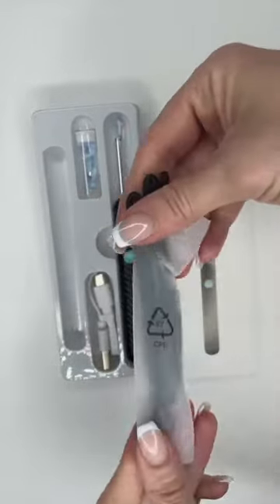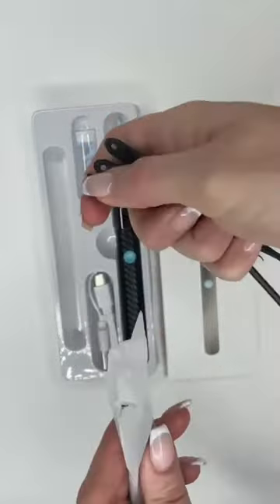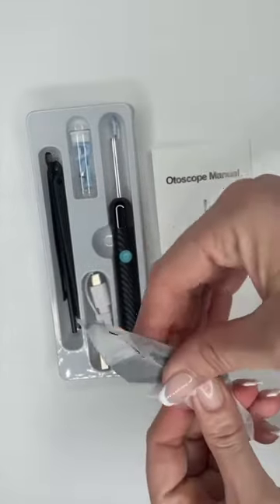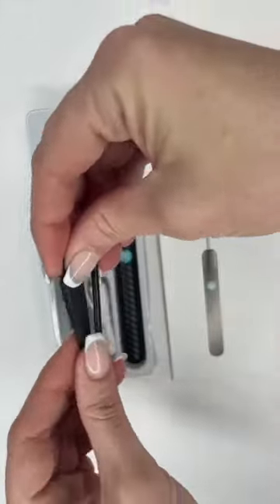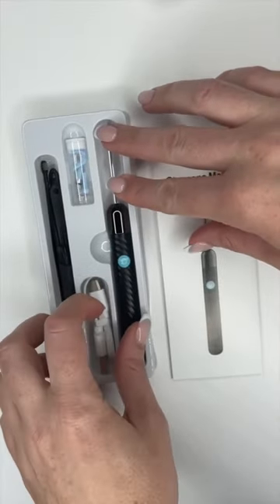Upon first opening the packaging, we see our lighted ear curette. The packaging also includes six silicone tips to put on the end of the lighted ear curette, and they are different arc shapes to help be able to get wax out at different angles. There was also an eight-piece ear cleaning tool set as well, though I really only focused on the lighted ear curette today.